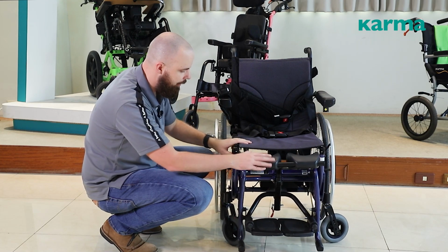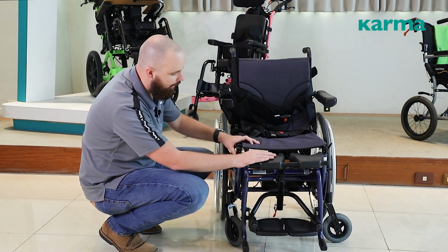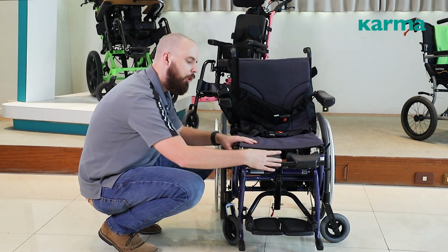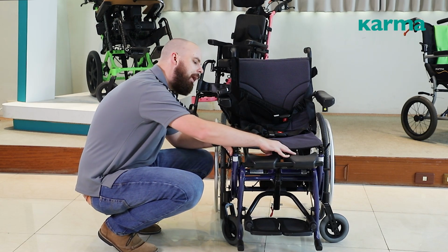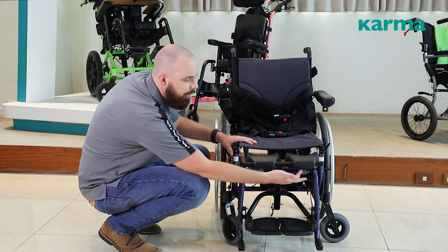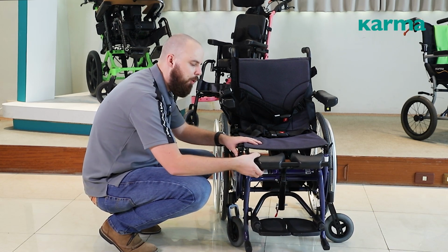Down here on the knee, this is the knee support pad. Again, very helpful when standing. We have a few different adjustments. The first one is the spacing between the knees, so we can move these pads further out if the legs are positioned further outward. And then they're about all the way as far as they can go in. There are just bolts under here that you can use to move these around. These are a soft foam material.